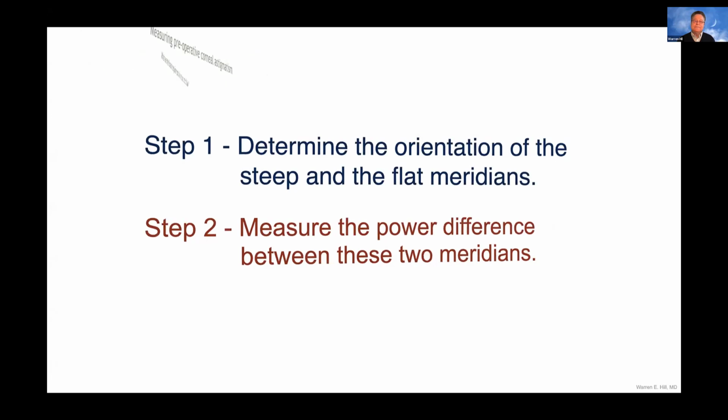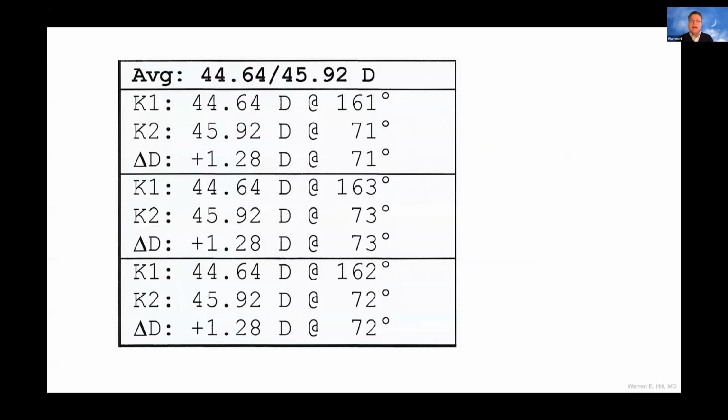Now you might say, well, I've got a dearly beloved IOLMaster, I've got an Argos, a Movu, I have a Tomey device. I mean, my keratometry is wonderful, and that may be the case. But let me just show you how it's easy to get fooled.